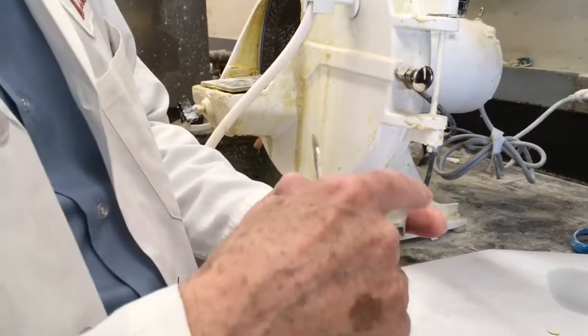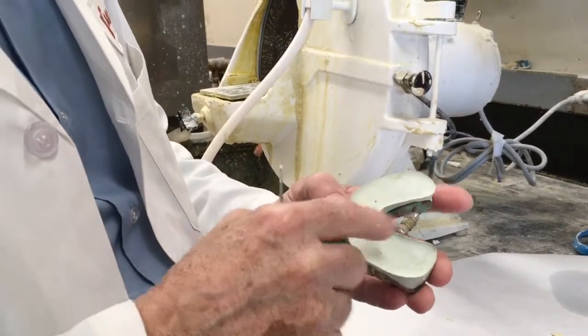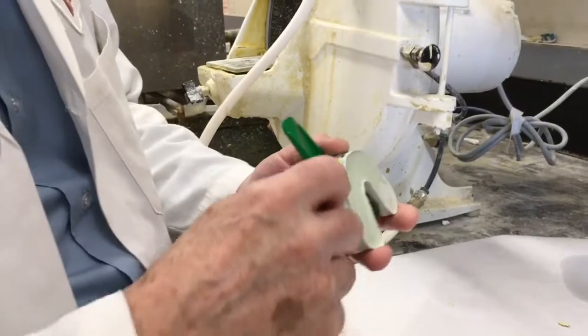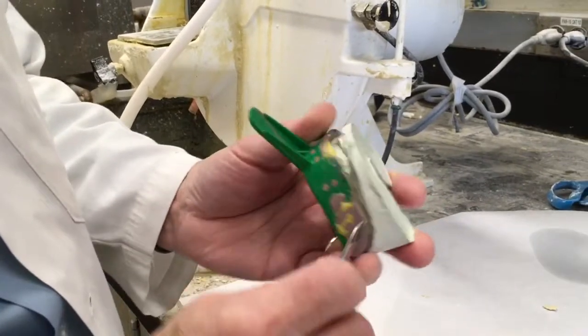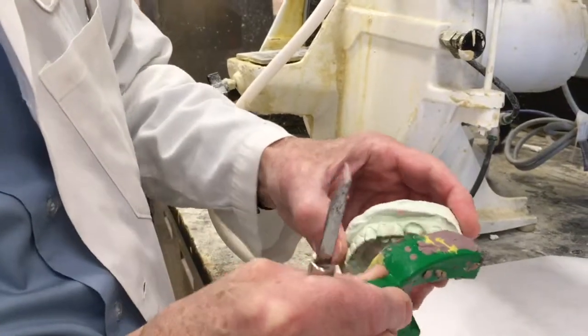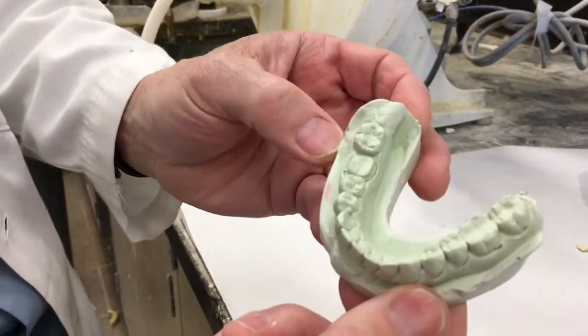I peeled the boxing wax off before the stone got too hot. If you can catch it before the stone gets really hot and melts the wax, it peels right off easily. Then we've got to pry this off gently — a little here, a little there — especially on your typodont, which has big gingival embrasures. We should be able to take that out and we've got our cast, bubble free.